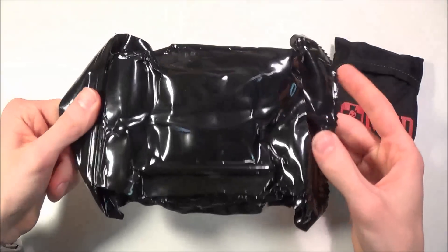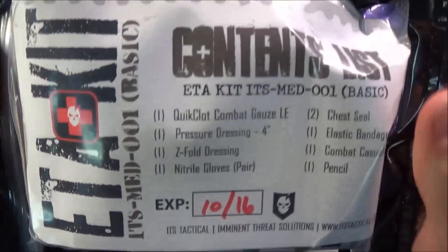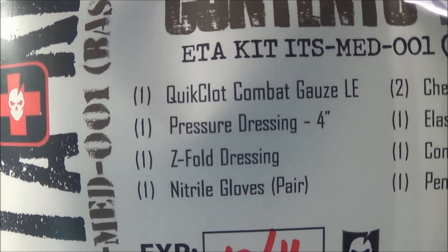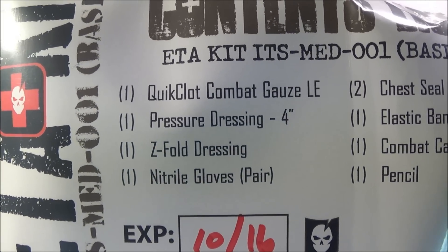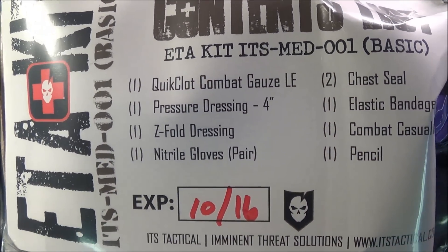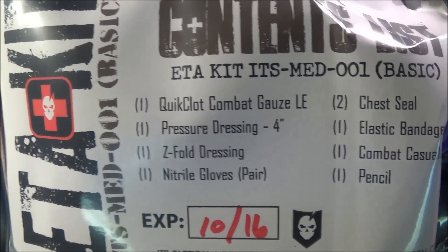Right off the bat, this is what you're going to get — it is a vacuum-sealed package. You can see it has a contents list right here. You have a QuikClot combat gauze LE, for law enforcement, and it is a hemostatic gauze. QuikClot is a blood-coagulating material — the QuikClot combat gauze is a hemostatic gauze, meaning it coagulates blood and stops bleeding.